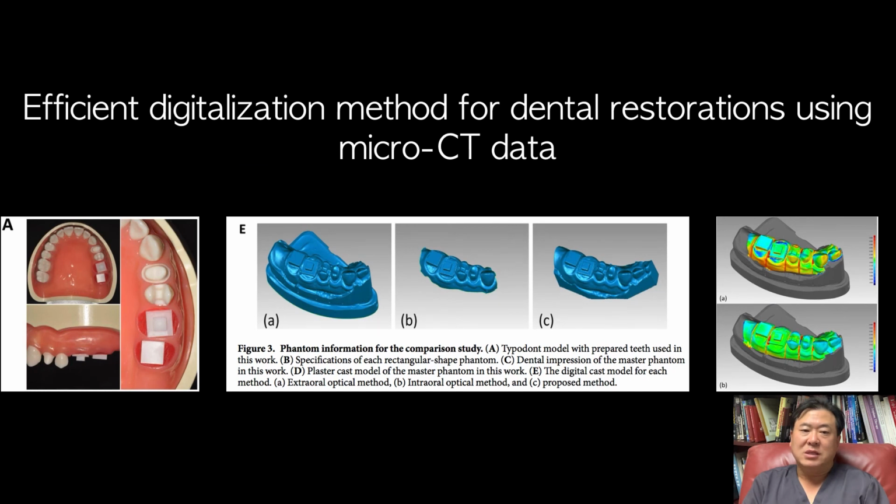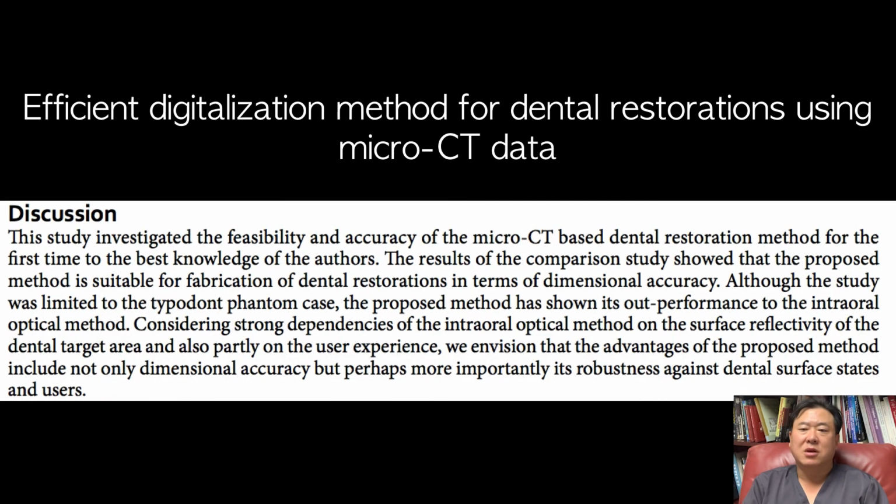They micro CT scanned the impression of this typodont and analyzed the accuracy. And it was concluded that the micro CT scan data was far more accurate than intraoral scan method.